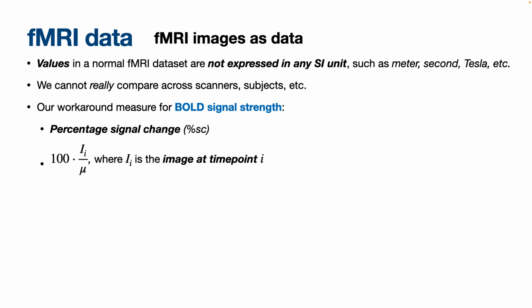So you can get huge signal fluctuations in these brainstem regions, right? Where the blood is pulsating really strongly, you get huge fluctuations, right? But it's very easy to get 40% signal change by headbanging in the scanner. That's not really what you're interested in. That would fall under the noise, right? What we are interested in is functional signals that tie to neural activations through this blood response. Yeah. And so if we're interested in this in terms of percent signal change, what are we looking at?